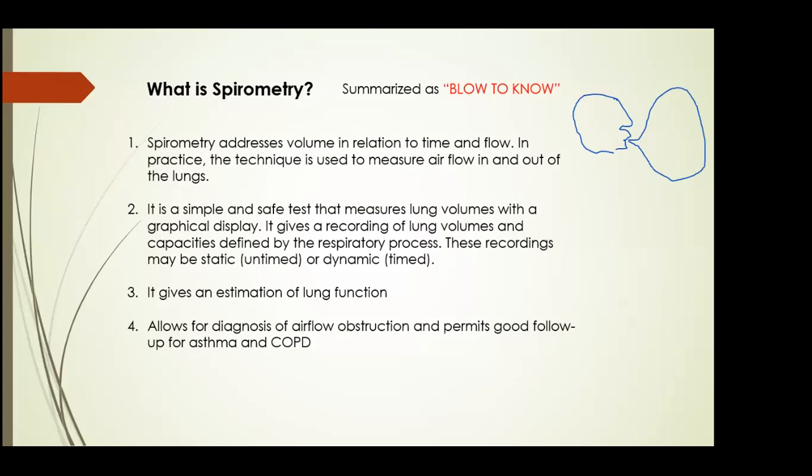If you assume this part is airtight, so it does not allow any leakage of air between the balloon and the mouth, it means when you inhale, whatever volume you take in will reduce this balloon by that volume. So now your inhalation volume can be captured by looking at the difference between when you blew the air out and when you inhaled. So this is your inspiratory volume.